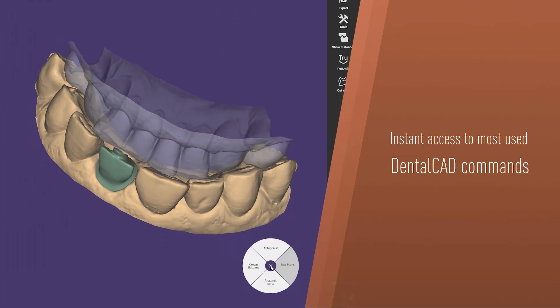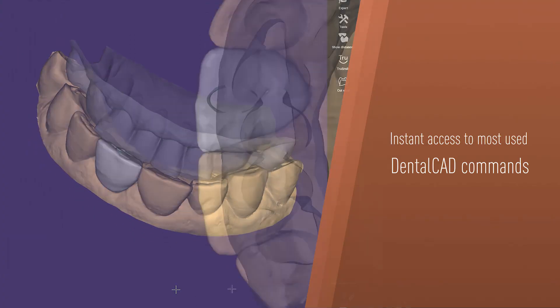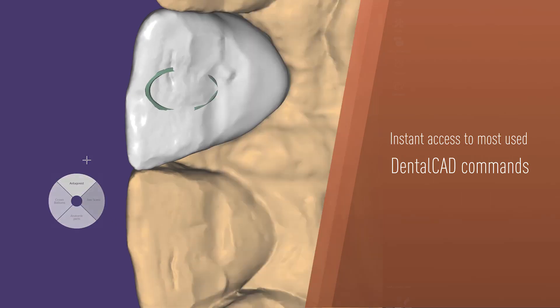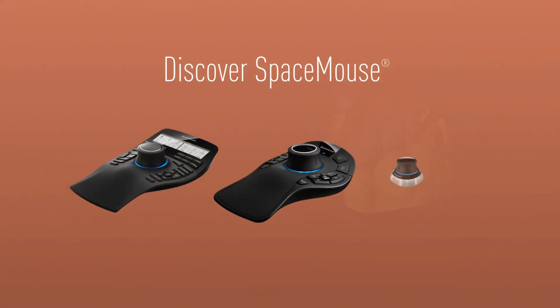You can also program these buttons, assigning your favorite commands, radial menus, and setup macros, ensuring your preferred tools are always at your fingertips. Discover the Space Mouse product line now.